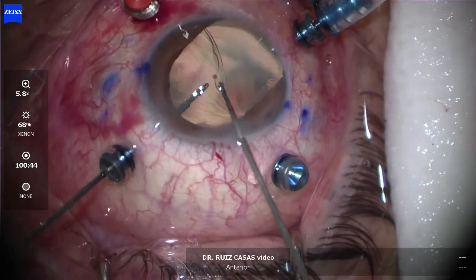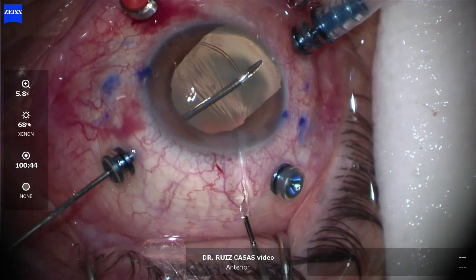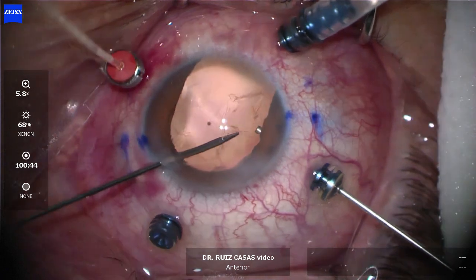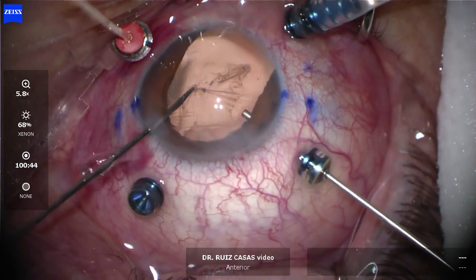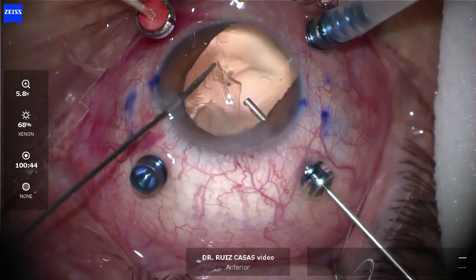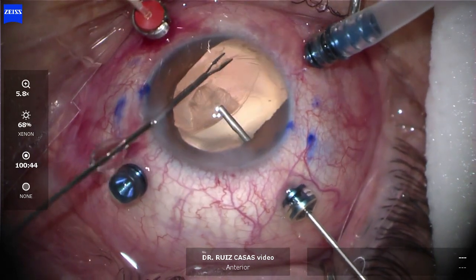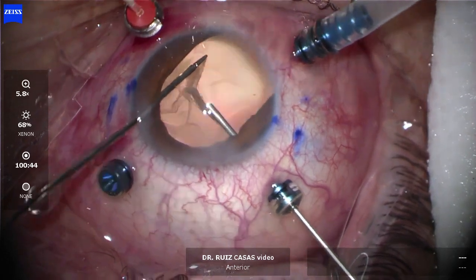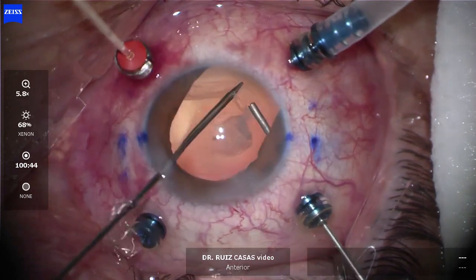You need to do this very gently to avoid any trauma to the retina, using the forceps as a fulcrum. Now I'm removing the capsular remnants. As you can see, not only are there lens fragments when you do this type of cataract, but the posterior capsule is not completely clean and is bound to contract afterwards.